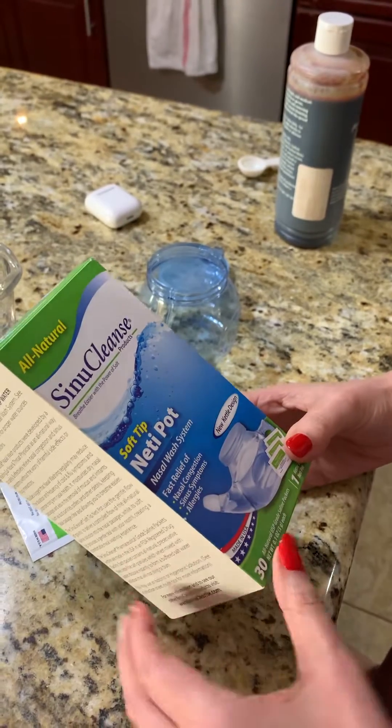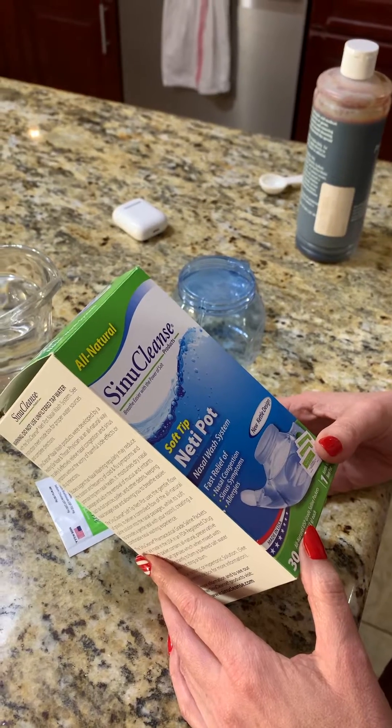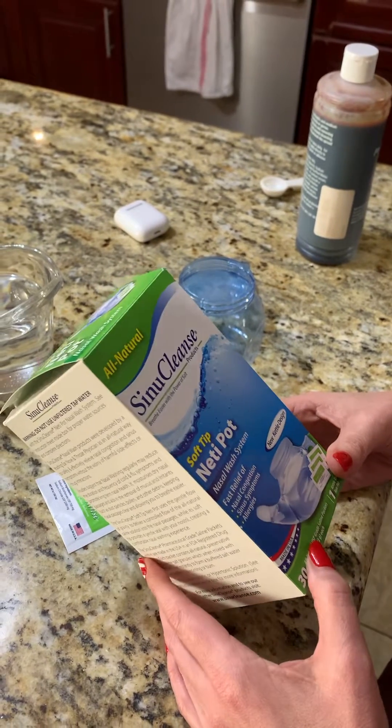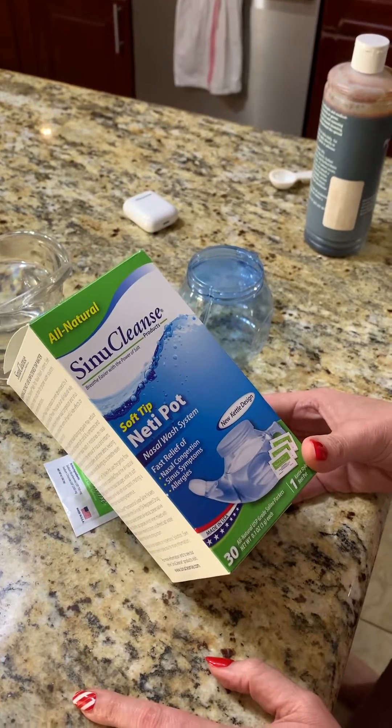Hi, good morning! This is Monica, quality NP Health Services, your favorite nurse practitioner. Today I'm going to be showing you how to make the betadine nasal wash. I have here just a generic form of a neti pot.